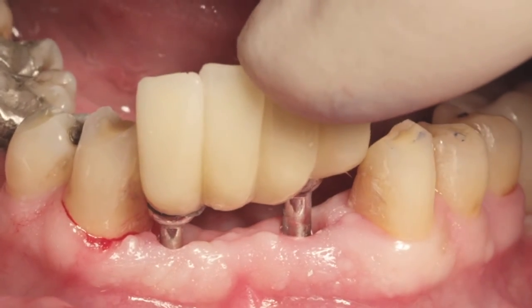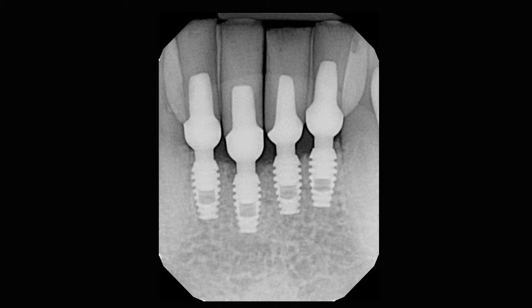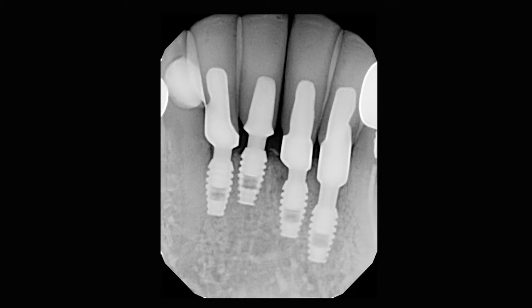Although two of these 3x6 Bicon narrow implants are capable of supporting a four-unit mandibular incisor bridge, they are also capable of giving you the opportunity to offer your patients four individual prosthetic teeth with the inherent benefits of individual interproximal papillae.